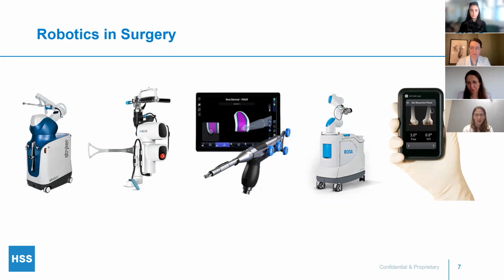So I think trying to find a surgeon just based on one specific type of technology that they use may not be as advisable as trying to find a surgeon who you feel comfortable with, who you trust, and who is focused on hip and knee replacement surgery. But having said that, for surgeons who are experienced with these technologies, both the robotic side and the computer navigation side are helping surgeons be more accurate and precise in where they place their implants. I think it's very exciting.